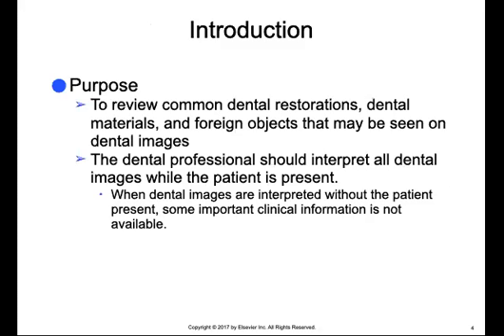So, dental images are an important diagnostic tool that enables a practitioner to view dental restorations and dental materials. Dental images are also useful in identifying and locating foreign objects. The purpose of this chapter is to review some common dental restorations, dental materials, and foreign objects viewed on dental images.